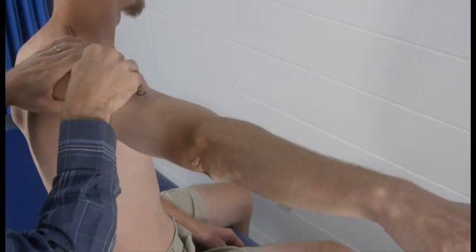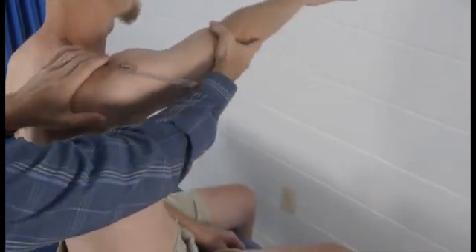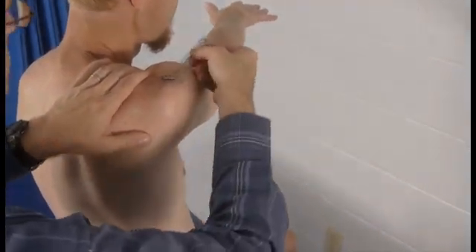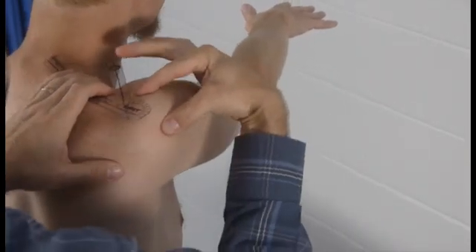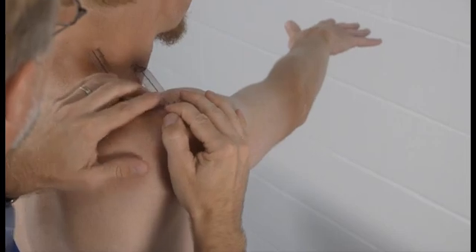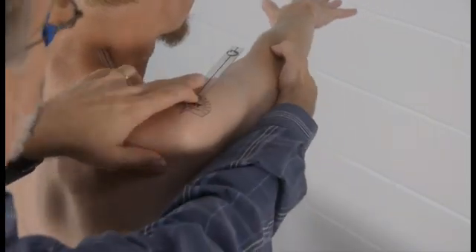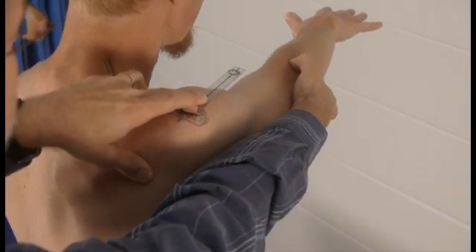The ending position is the patient adducts the arm, all the way over, and I have to re-palpate for that humeral head — still right about there. Again, re-line up your stationary arm and the moving arm, which is lined up with the lateral epicondyle.